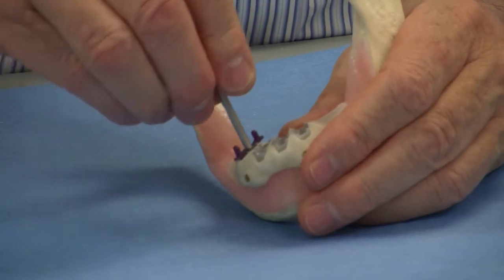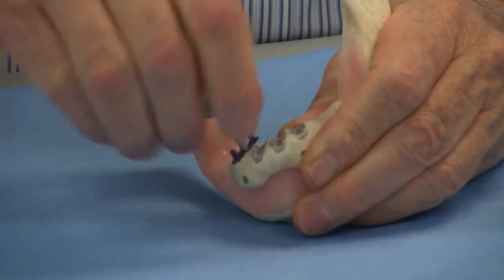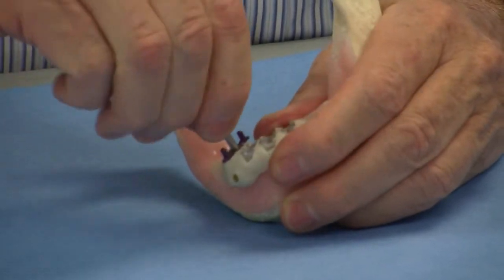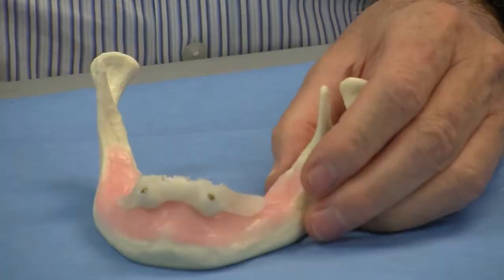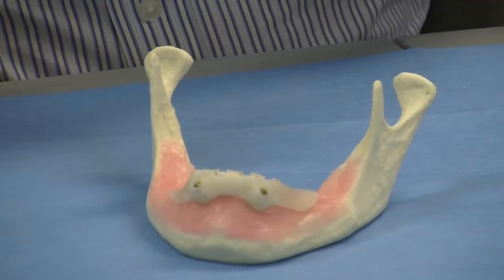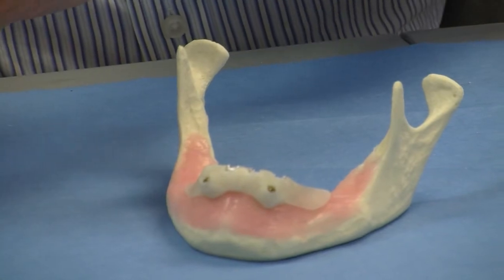All these instruments can be leashed with a silk suture to avoid swallowing by the patient. So now we are ready to carry on the cortical drilling.